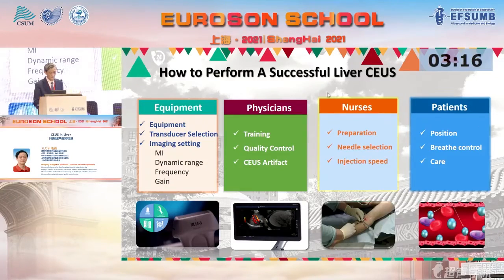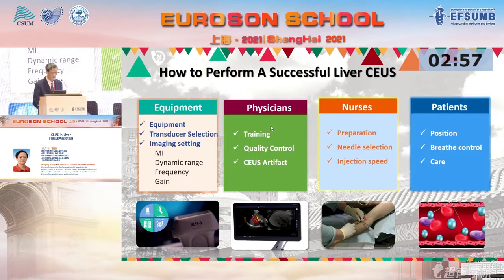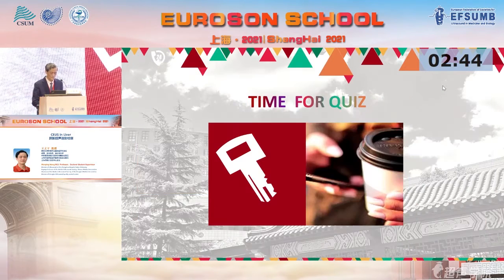So I think about how to perform a successful liver lesion CEUS. There are many factors, for example, the equipment, physicians, nurses, patients, and so on. Because the time is short, this time is for the quiz.